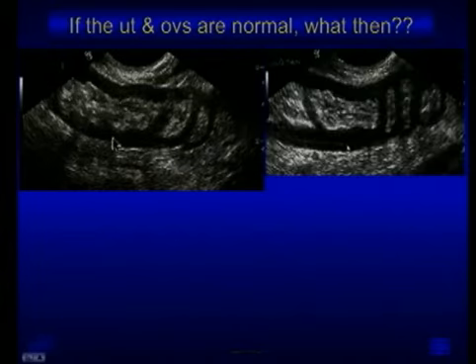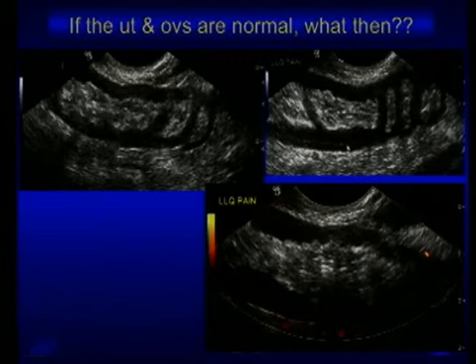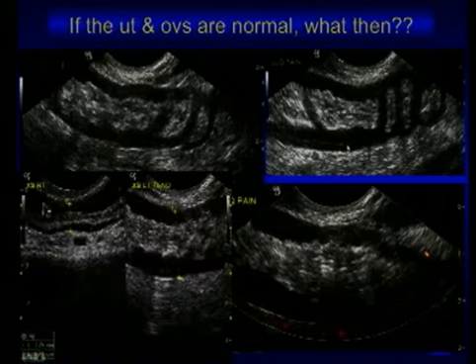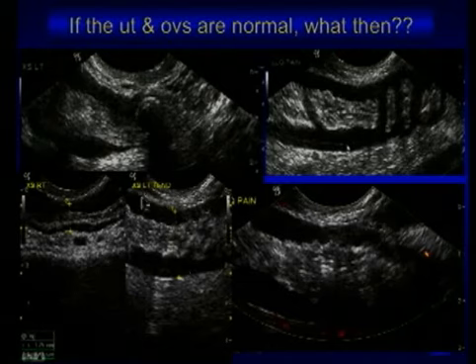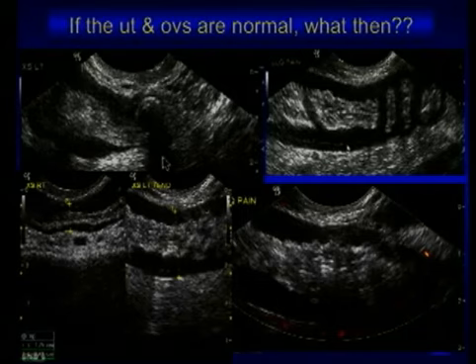This is absolutely abnormal. Thick-walled bowel with some striations, no significant increased vascularity. This is an abnormal loop of bowel. If you compare it on the right-hand side to a loop of bowel which is normal, this is an abnormal loop of bowel. Let's look now, and there's actually a diverticulum with a distal shadow. So this is diverticulitis with an inflamed area of sigmoid colon.